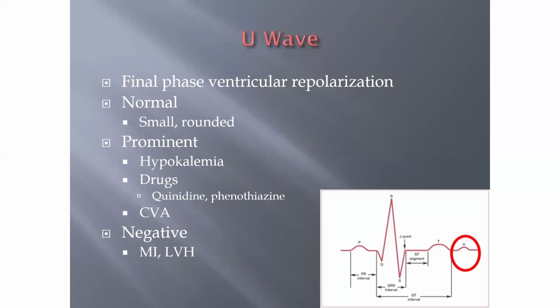Anonymous attendee wants to know, John, when do we shock the patient? Thank you very much for that question. When a patient has ventricular fibrillation, that is a shockable rhythm. You will need to shock your patient.